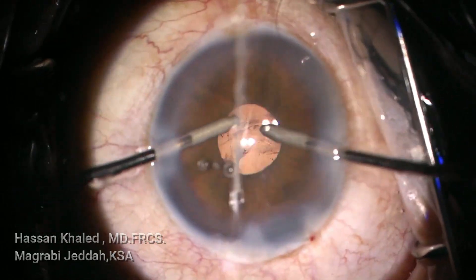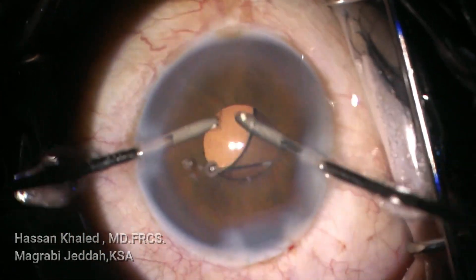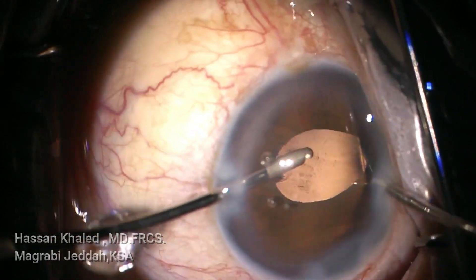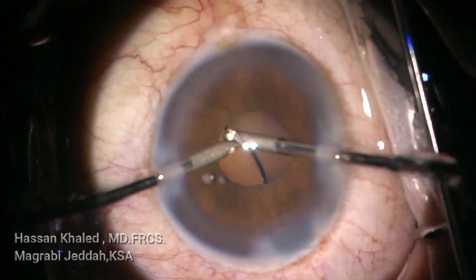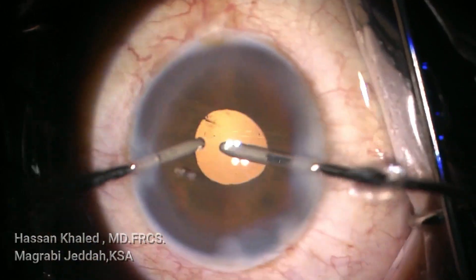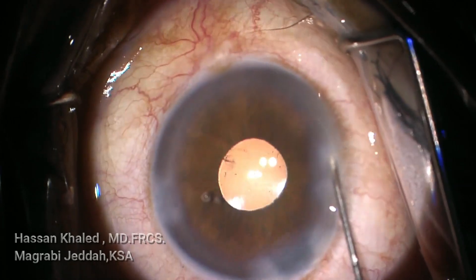You can see the pupil by the end of the surgery is about 2 millimeters in diameter. Just go slightly behind the IOL and remove the remaining cortex. Clean all cortex and be sure that your IOL is inside the capsular bag. Now removing the cortex behind the IOL, and then performing stromal hydration of the incision.